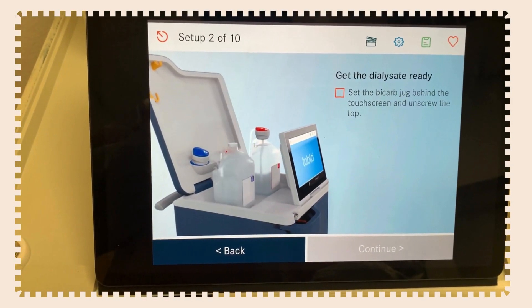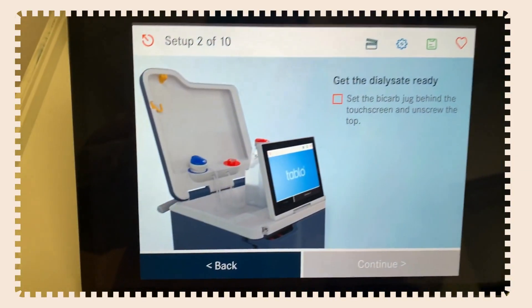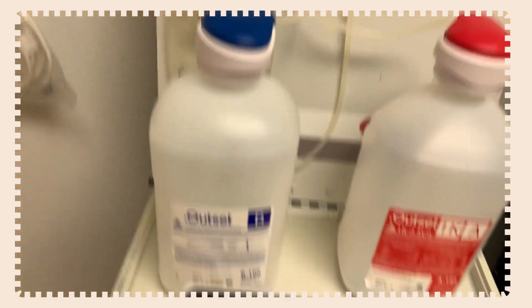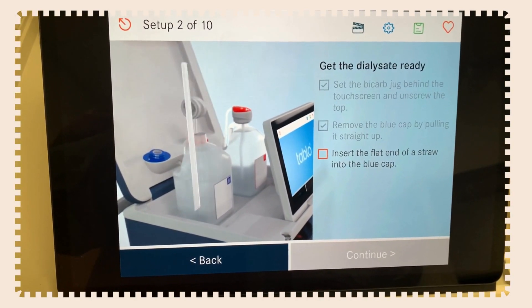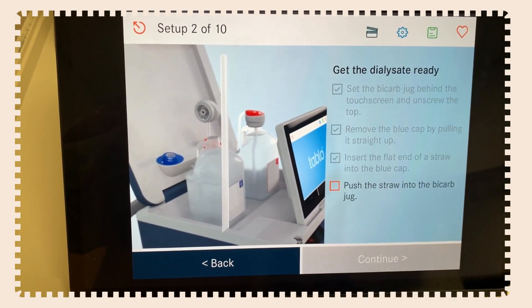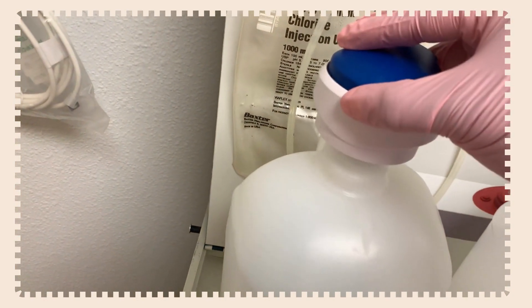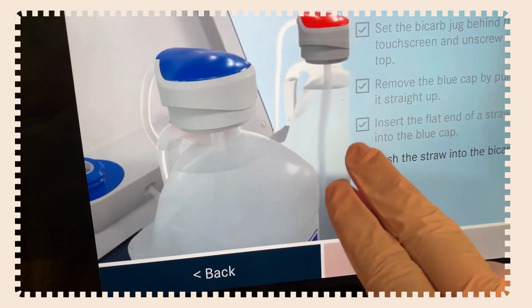Now get the bicarb dialysate ready. Set the bicarb jug behind and unscrew the cap. Remove the blue cap by pulling it straight up — same routine as the first jug. Insert the flat end of a straw into the blue cap and push the straw into the bicarb jug. Once that's done, confirm completion and hit continue.